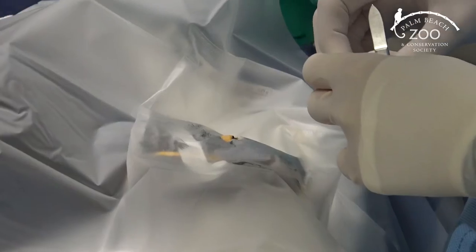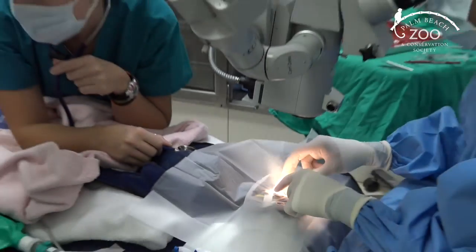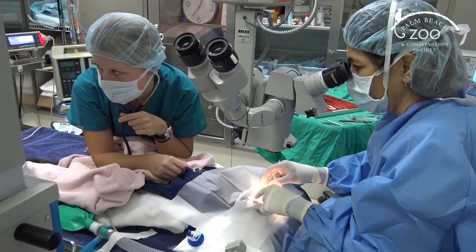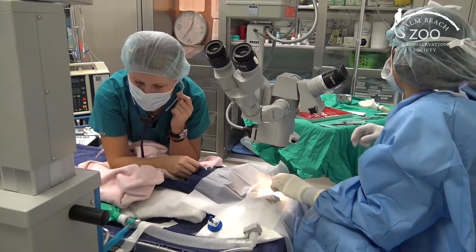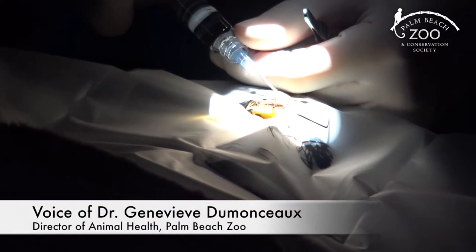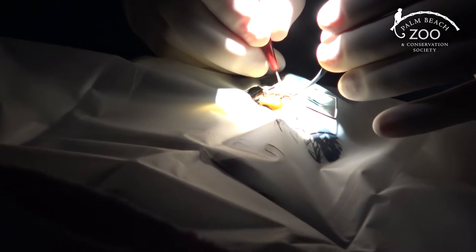Dr. Karastro is preparing the eye and getting ready to place a speculum. She has to put a speculum in to hold the eyelids wide open so she has a full field to work on the eye. Her next step will be to rinse the eye and then make her initial incision into the cornea itself.